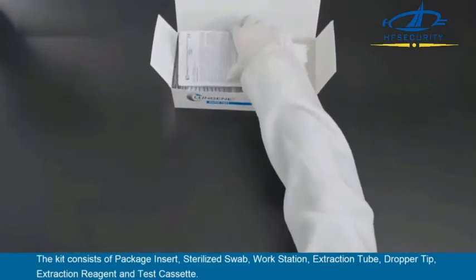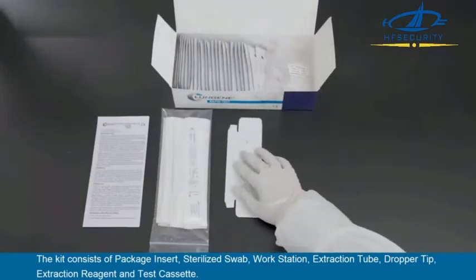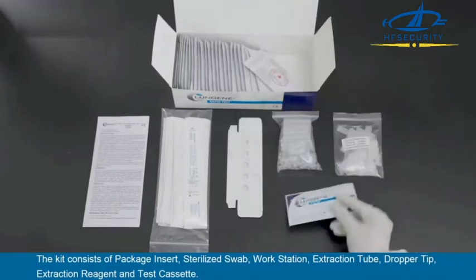The kit consists of a package insert, sterilized swab, workstation, extraction tube, dropper tip, extraction reagent, and test cassette.